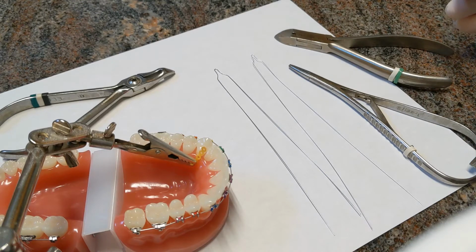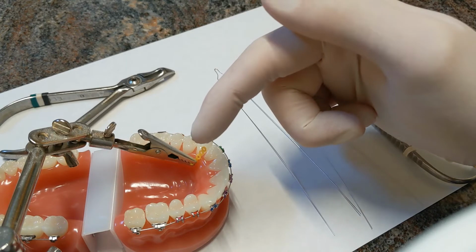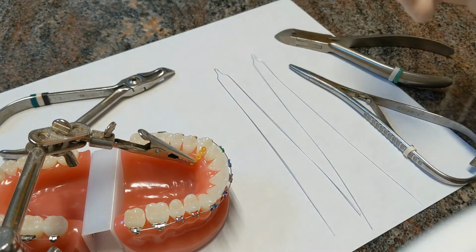Okay, so we're going to go over how to place a hook on the end of a gold chain that's been placed on an impacted tooth. And then that hook will be used to wear an elastic to pull that impacted tooth in a certain direction, the way it needs to go.